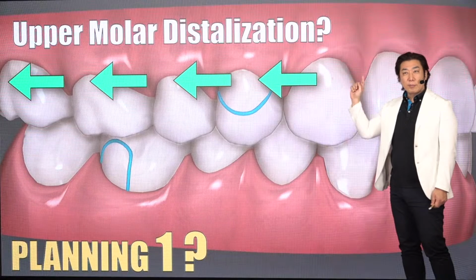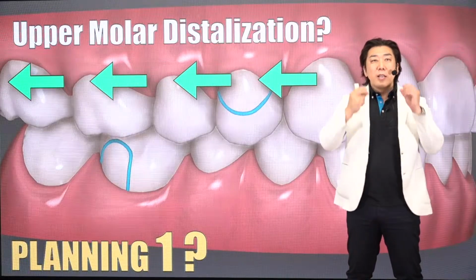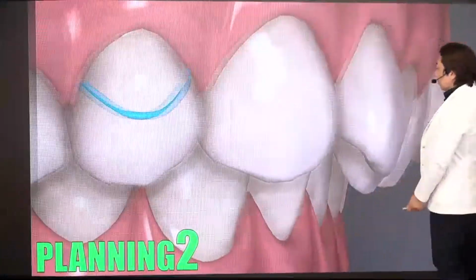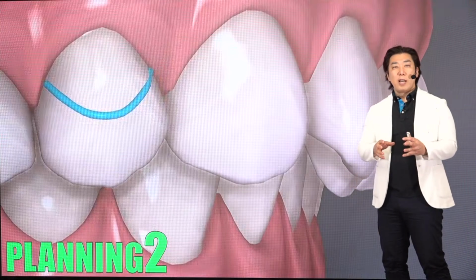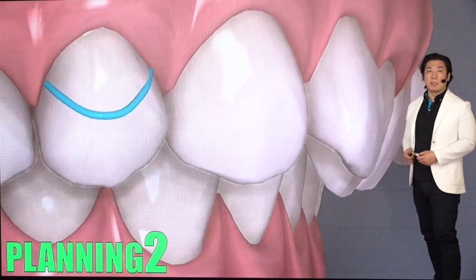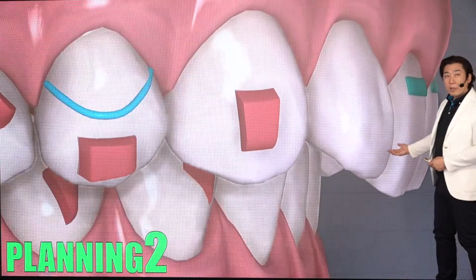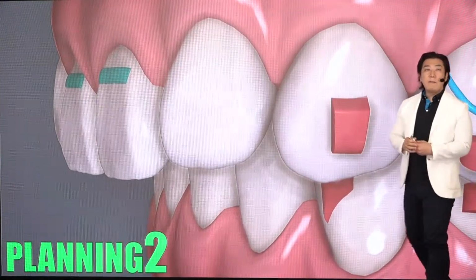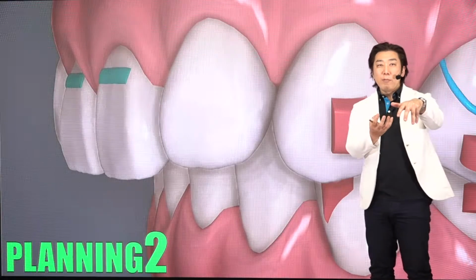Molar distalize first. Okay? Just now, in the 2021 generation, ClinCheck cannot change the joint, cannot change the muscle. Only the initial position is transferred onto the ClinCheck. This is planning 2. Planning 2's initial approach is not the second upper molars. Planning 2 focuses initially on the upper anterior incisors. Have a look. Initial staging controls the anterior teeth, like this. Proclination first. Easy to understand: if you plan upper anterior teeth proclination first, the patient's mandible will naturally go forward.